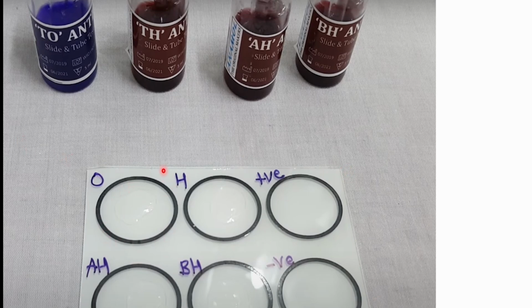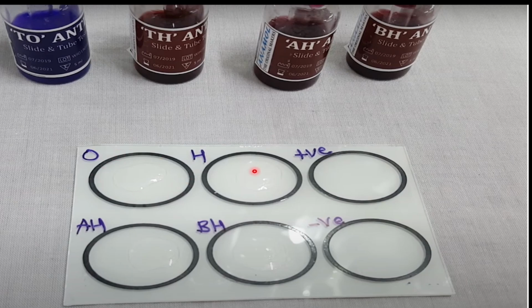So what do we have? You can see here we have a ring, two, third ring, four, so 6 rings we have. 1, 2, 3, 4, 5, 6. What is written here? O, H, positive, AH, BH, negative. So this is what is written here, so that there is no confusion.